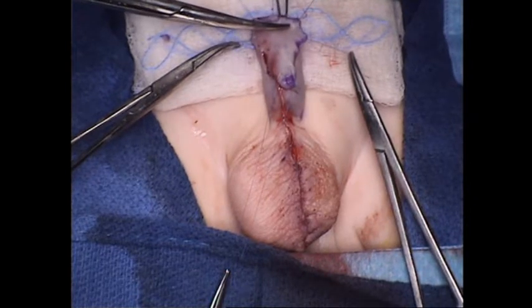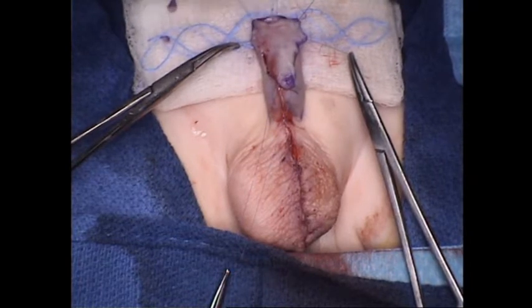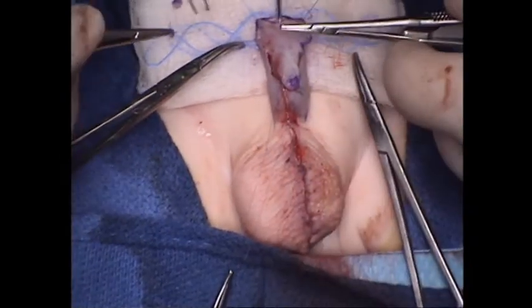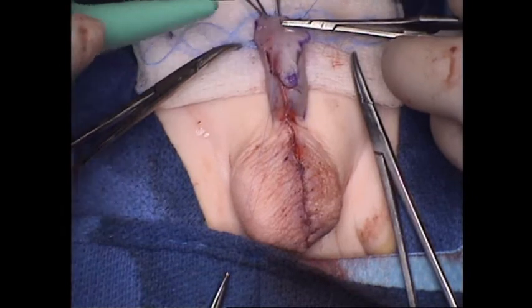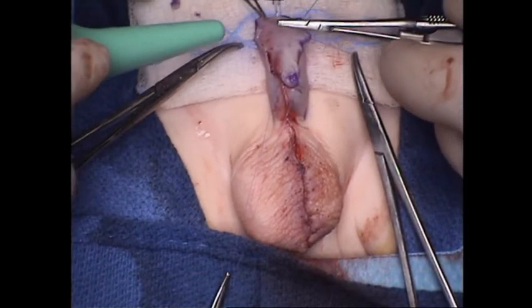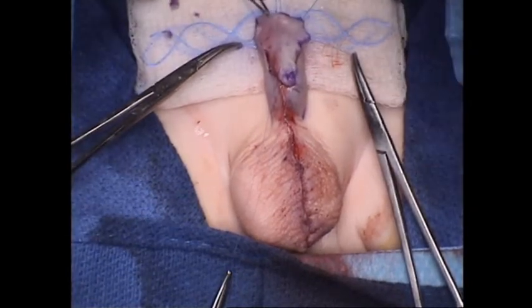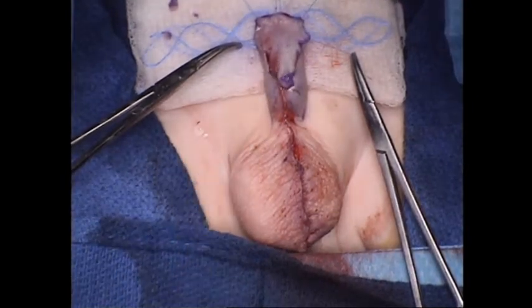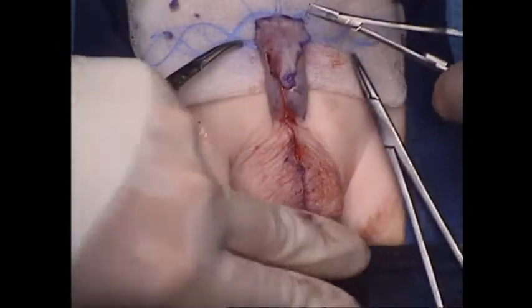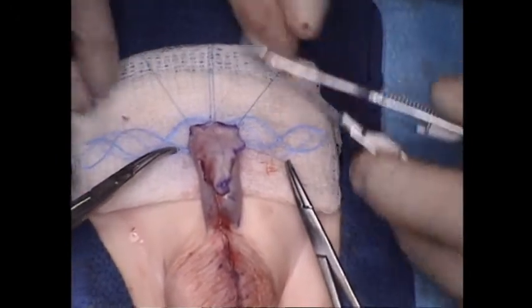I think there might have been a little skin folded under right here. Just going to trim that just a little bit to get it nice and flush. On the glands, so that we don't leave any visible marks. Let me move this. Sorry, it's going to make you a bit dizzy for just a second, but that way you can see just a little bit better.